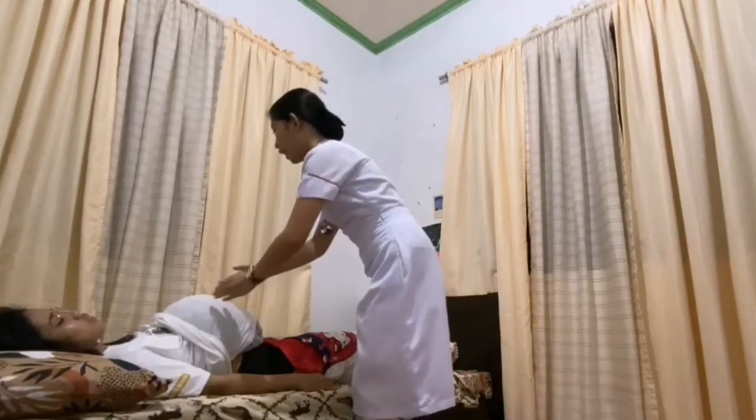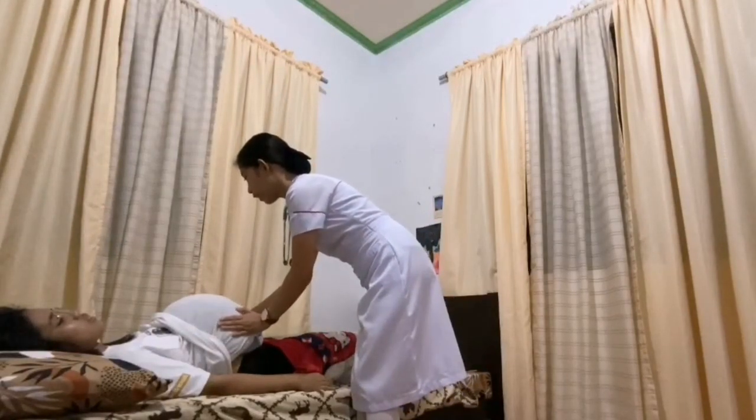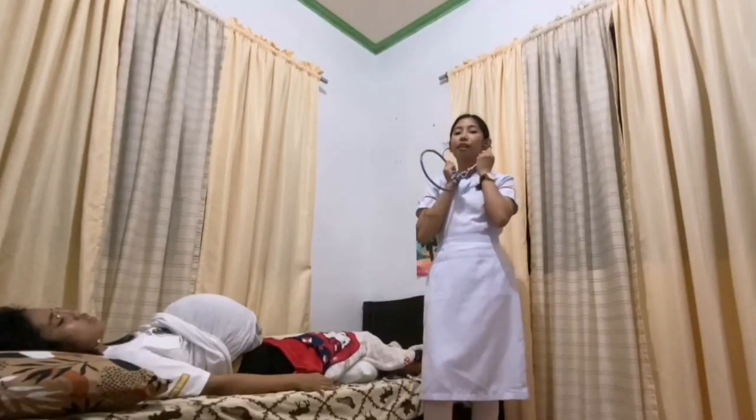So, in locating the fetus's back, you need to find the long hard structures, and it is felt on the left side of the mother. So the next thing is to place the earpiece of the stethoscope and listen carefully for a few minutes through the earpiece in order to provide accurate findings.